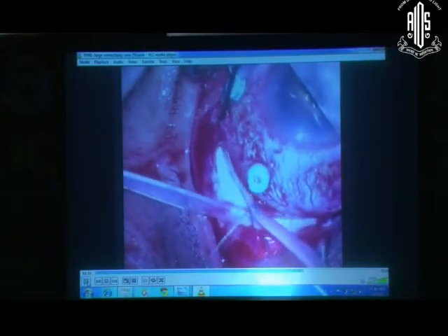So here I think at this stage we had chosen to put the buckle because of this anticipation, and I tightened it further to reduce the amount of retinectomy which may be required. So this is a situation where a buckle would help you reduce the amount of traction inside, because there's only so much you can cut if it's going very posterior, and you can see that it's come so close to the macula, the posterior lip of the retinectomy. But now you can see that with the buckle there's adequate support on the peripheral side, which allows you to get some extra leeway as far as giving a tamponade externally and reducing the need for retinectomy is concerned.